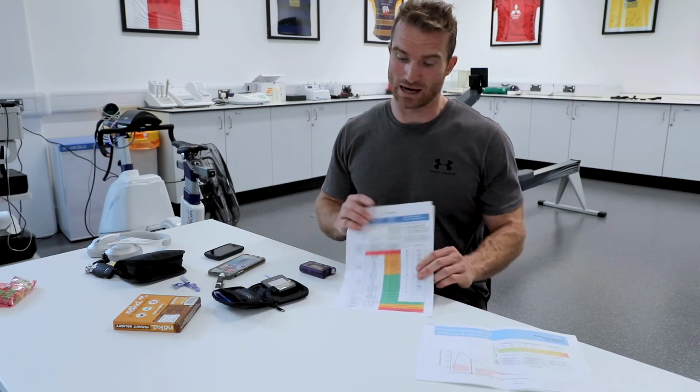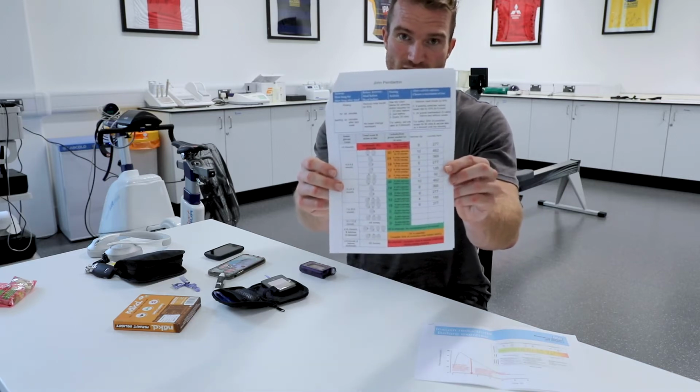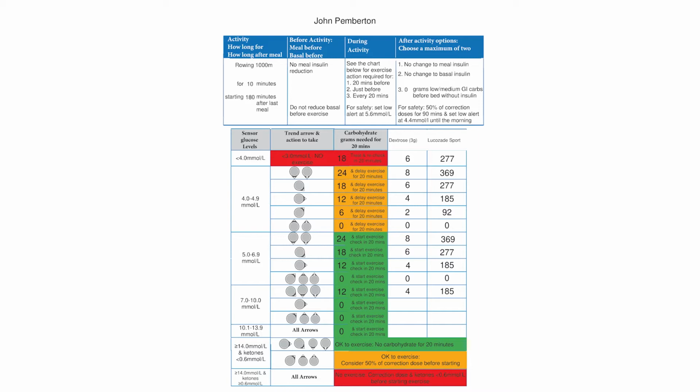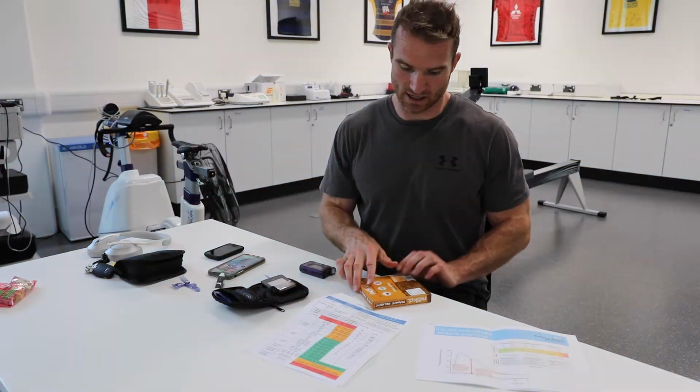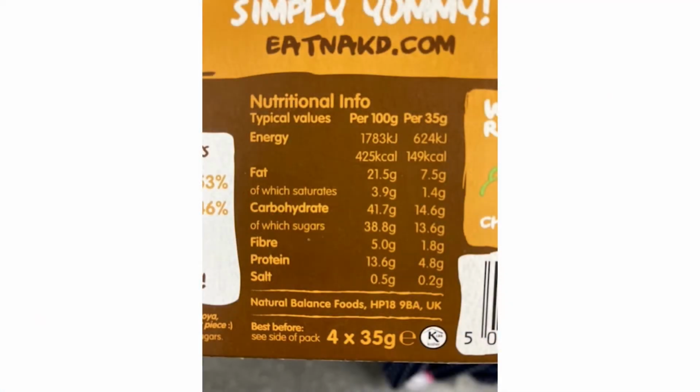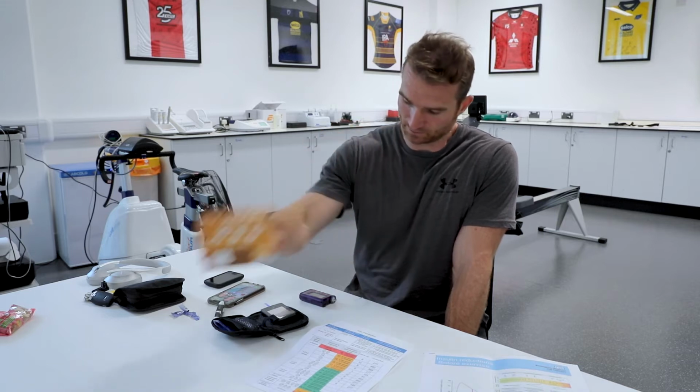Now, if it doesn't balance out quite nicely and I should have done more of a reduction, we've got a plan here depending on what the glucose level is and what the trend arrow is on the CGM. We'll be able to give supplementary carbohydrates in the form of dextrose during the exercise to make sure that is maintained. So we'll check before, 20 minutes during, and then at the end of the 40 minutes. The plan here is to have 60 grams of carbohydrate. You can hopefully see on the back of there, each one of these bars is 15 grams of carbohydrate, which is 60 grams.